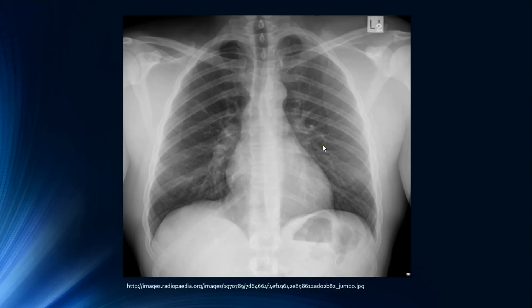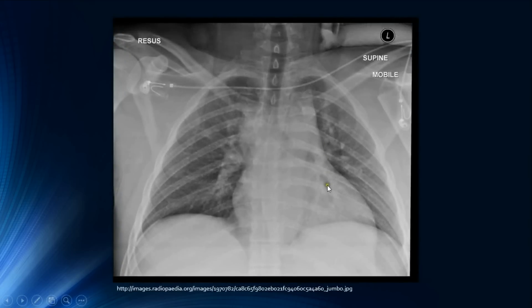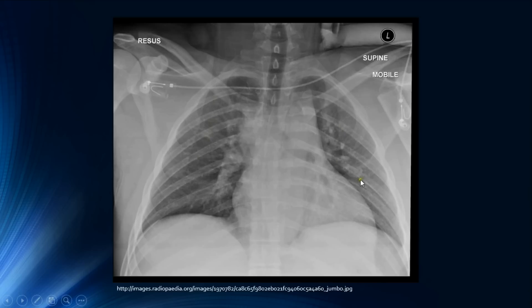Compare this chest radiograph to this one. You can notice that the heart size and the mediastinum appear enlarged, and you can also see that the scapulae are taking more of the lung shadow. This is because this is an AP chest radiograph taken in the supine position. Whenever you see the supine position label, you automatically know it is an AP chest radiograph.